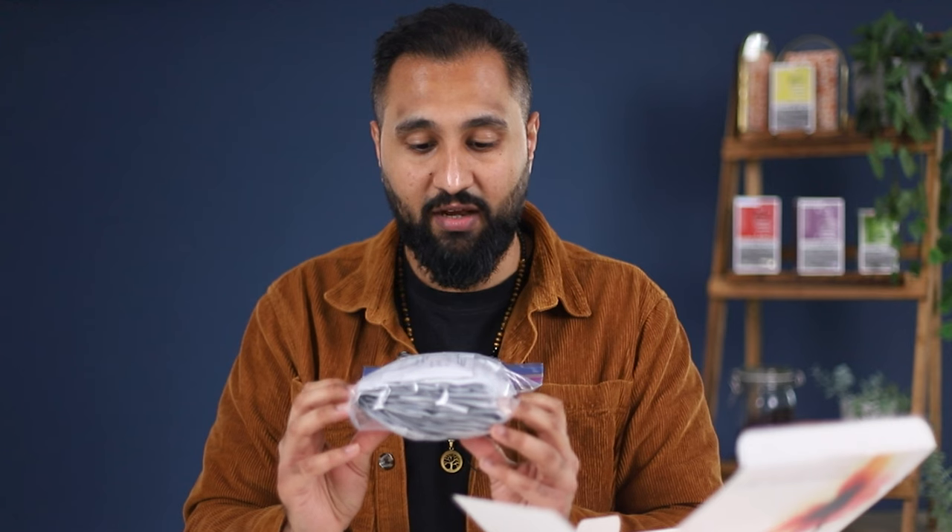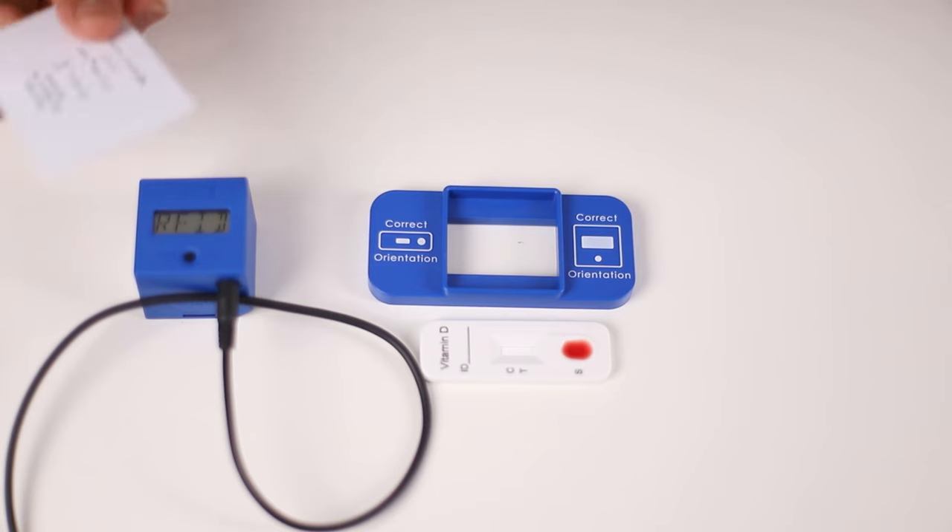You receive 25 vitamin D test strips, and these test strips are all endorsed with different lot IDs and reference numbers. In the packet of vitamin D test strips you will also receive your RFID card. This card programs the vitamin D reader and allows it to understand it's going to be doing a quantitative vitamin D test. Each RFID card correlates with the test strips, so for every pack of 25 test strips you order you will receive a lot-specific RFID card.